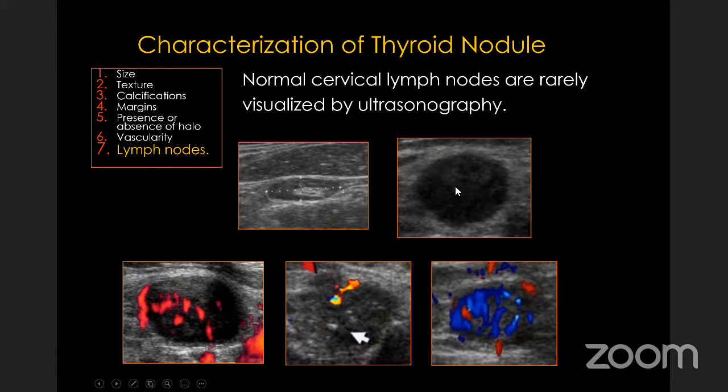Malignant nodules have different manifestations. It can be more round, as it is here, of a heterogeneous structure, commonly hypoechoic with a loss of hilum, sometimes with a cystic degeneration, or sometimes calcifications, as it is here. On color Doppler, it can show increased blood flow like it is here and here. However, fine needle aspiration still remains the most accurate tool for confirming or excluding malignancy.